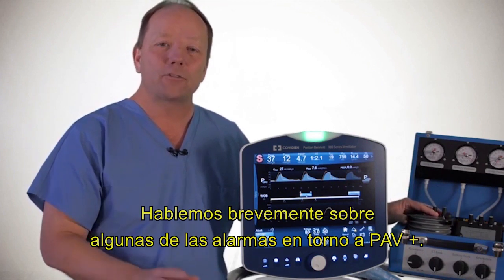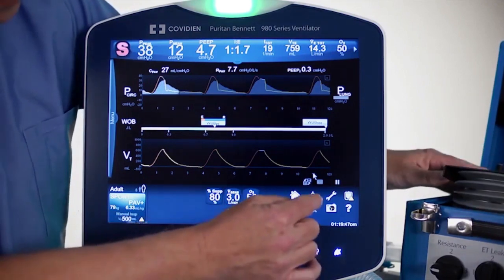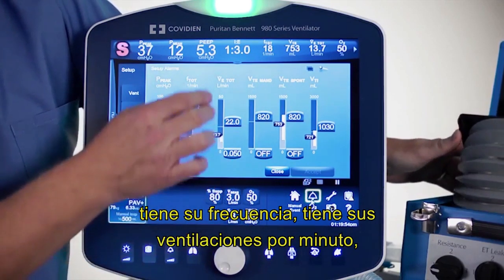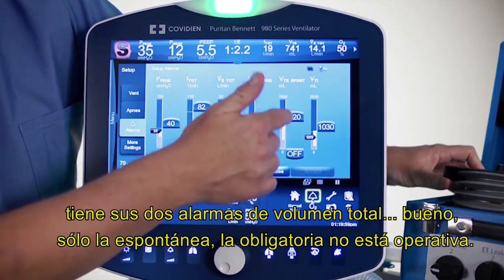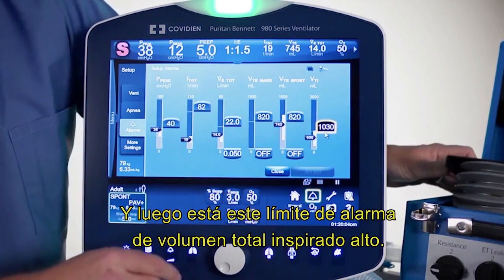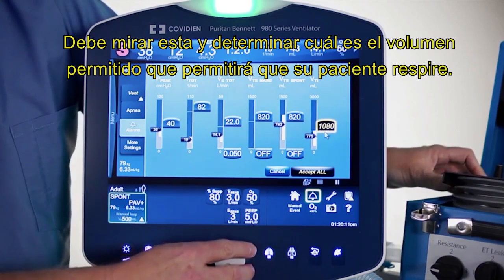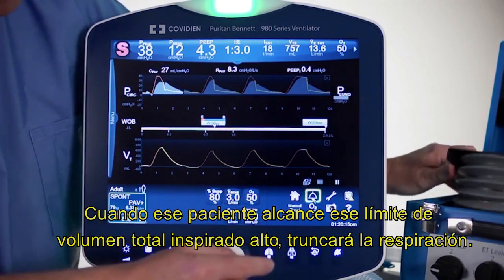Let's talk briefly about some of the alarms around PAV Plus. So if we go to our alarm screen, we can see that you have all your traditional alarms. You have your high pressure limits, you've got your rates, you've got your minute ventilations, you have your tidal volume alarms, both, actually, the spontaneous one; the mandatory one is not operational. And then you have this high inspired tidal volume alarm limit. And so you have to watch this one and once again determine what is the allowable volume that you allow your patient to breathe.